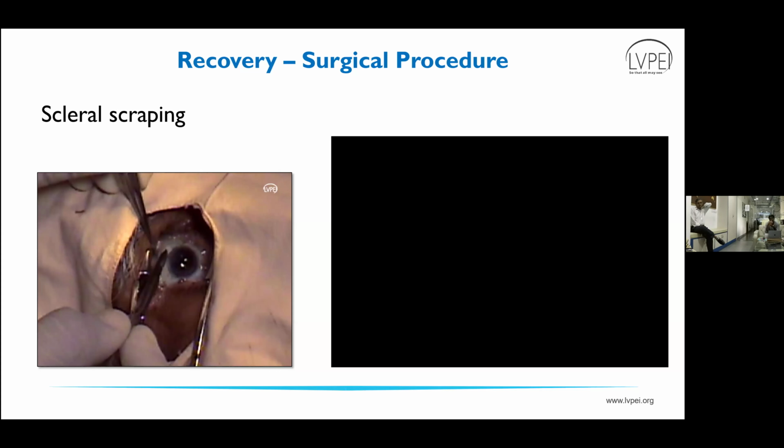You should not do any interrupted scrapings. If you start from the lower lid side, you have to continue towards the upper lid and then continue 360 and come back to the same position. So the scraping should be continuous and overlapping, with no interrupted scrapings.